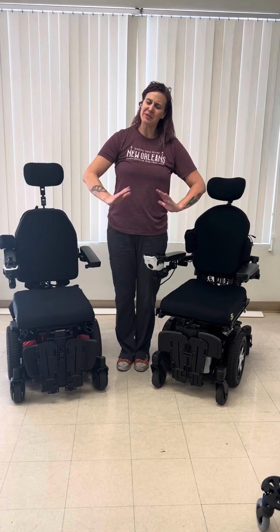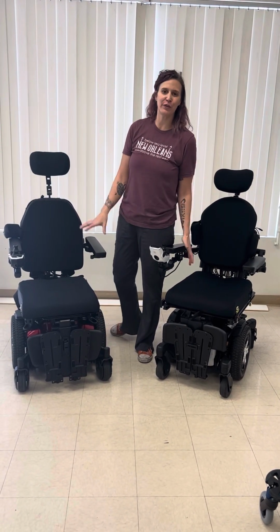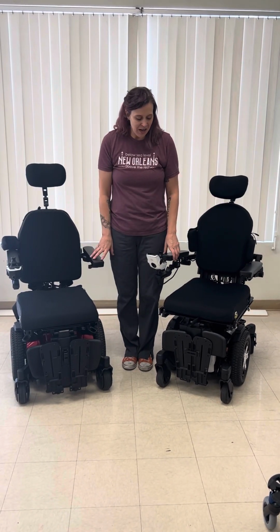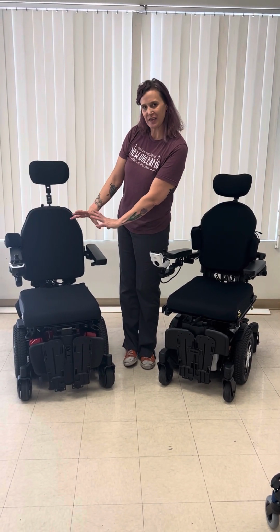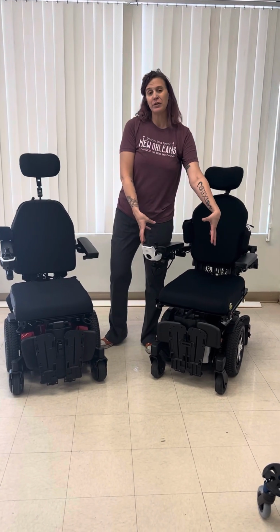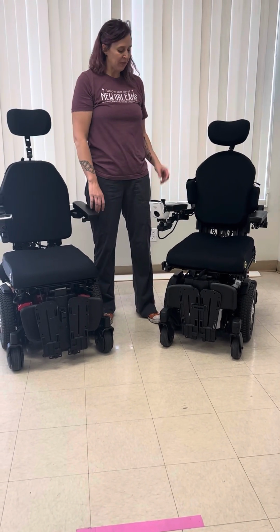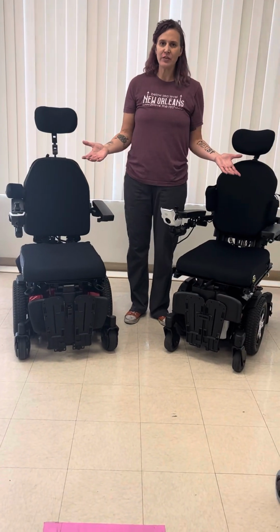And if you have some tight corners or tight hallways in your home, this might be helpful if you are looking at options for power wheelchairs to allow you to get to those spaces. So I'm going to be comparing a standard mid-wheel drive chair, this is an Edge 3.0 from Quantum, and then we have their Stretto wheelchair, which is a narrower base. They've been offering this since about the fall of 2019. So there are some key differences, but I want to go over the benefits of it first.